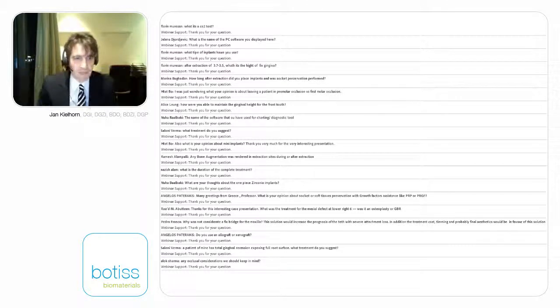Second question would be from Emil Kalinowski. Yes, I use PRF. PRF is a very good and predictable method, because you can improve quality and healing not by having any bone morphogenic protein or whatever, but this fibrin membrane just gives the body's own factors to make it heal very fast. So we like to put it on top of our grafts. I really like these fibrin membranes, and I think they improve healing and give you more safety for closure of the flap, so that it stays closed.